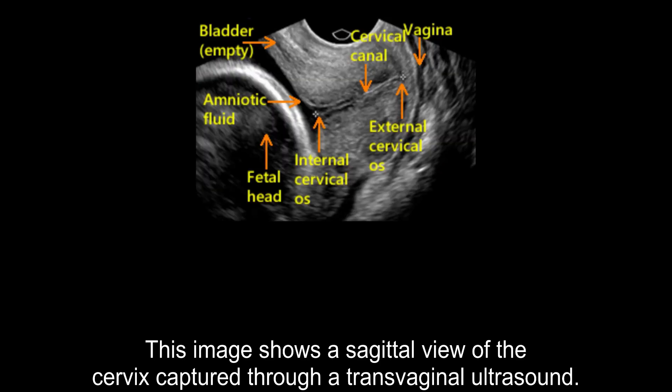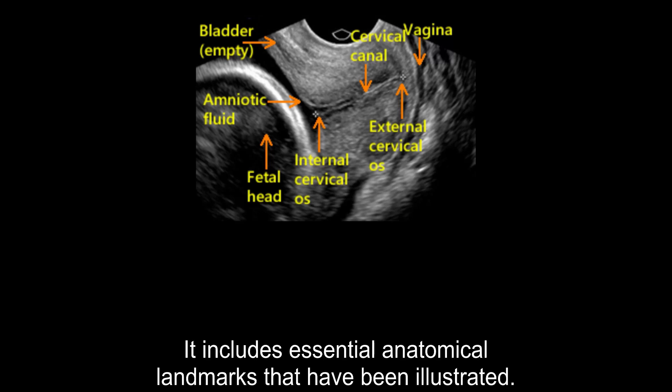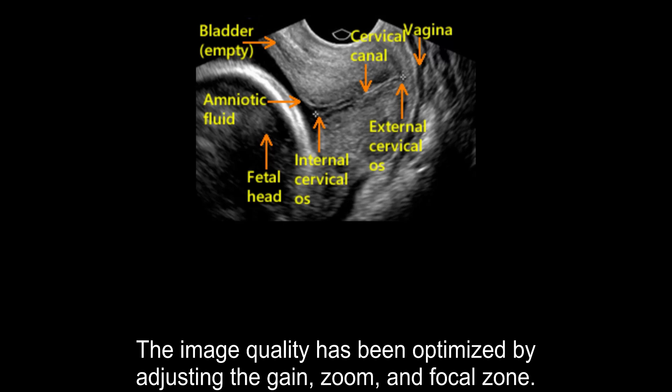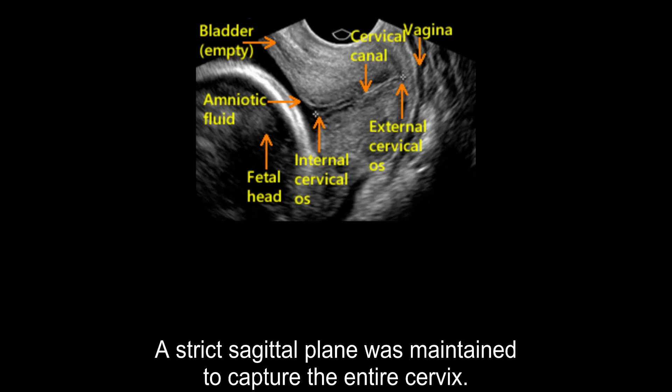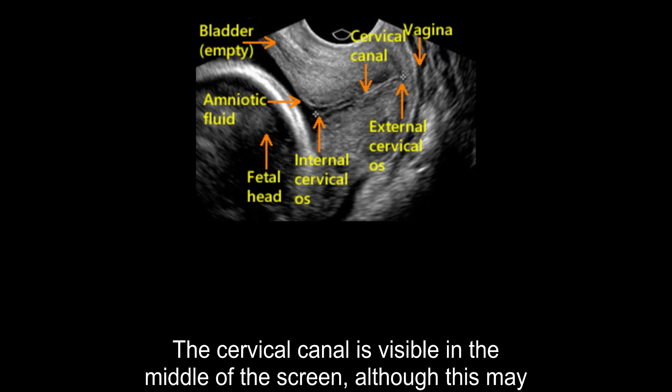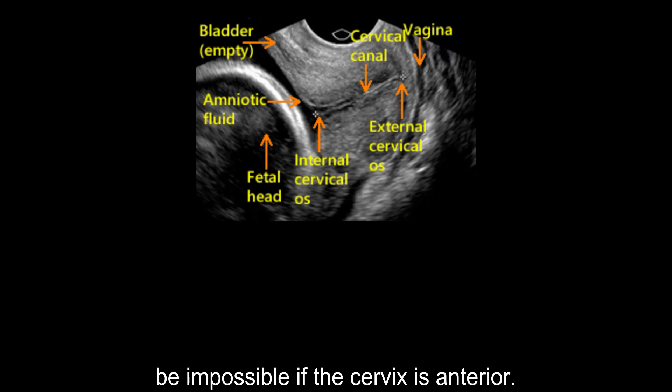This image shows a sagittal view of the cervix captured through a transvaginal ultrasound, with essential anatomical landmarks illustrated. The image quality has been optimized by adjusting the gain, zoom, and focal zone. A strict sagittal plane was maintained to capture the entire cervix. The cervical canal is visible in the middle of the screen, although this may be impossible if the cervix is anterior.